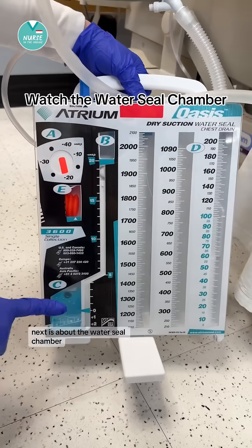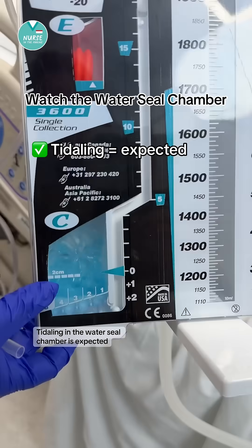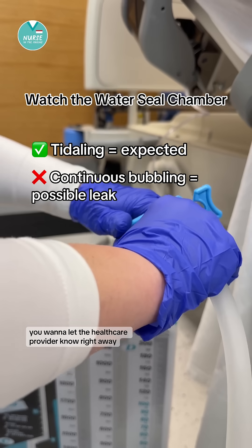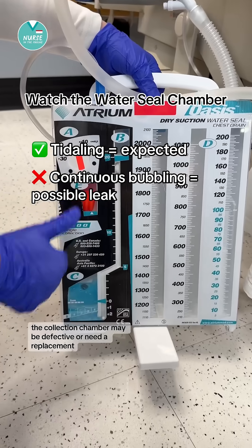Next is the water seal chamber. Tidaling in the water seal chamber is expected, but continuous bubbling can indicate a leak. If you see this and it's a new finding, you want to let the healthcare provider know right away. The collection chamber may be defective or need a replacement.